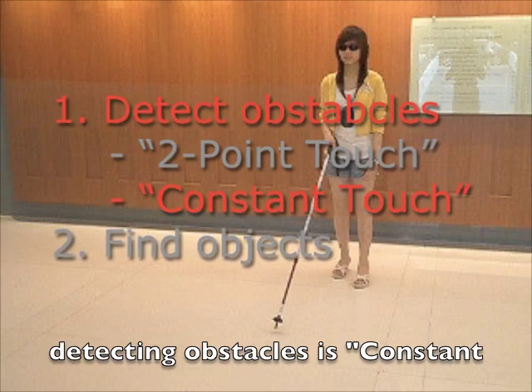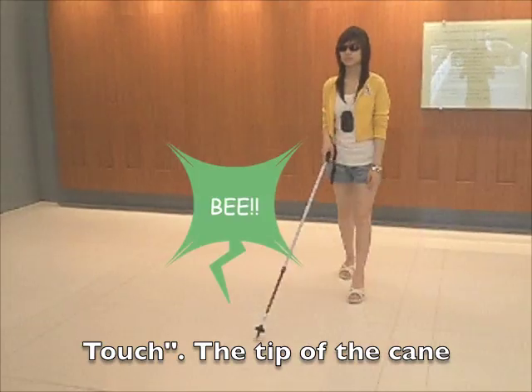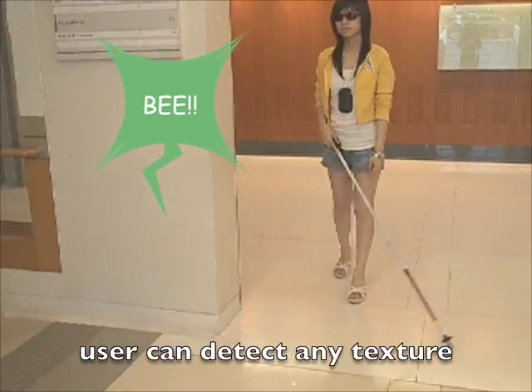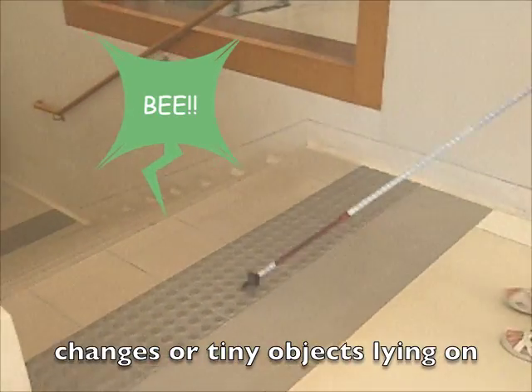Another technique used in detecting obstacles is constant touch. The tip of the cane should be constantly in touch with the ground surface, so that the user can detect any texture changes or tiny objects lying on the ground.